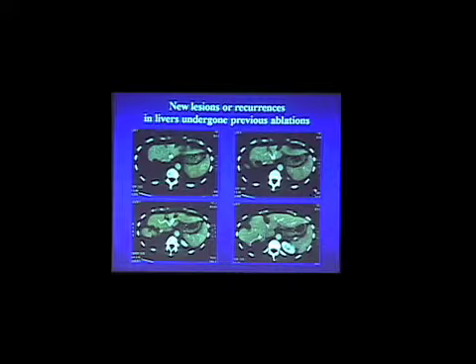A patient with colorectal NET, a young patient, who had received surgery again, and then he started to be ablated. Now we have ablated this young woman 9 times for new metastasis coming out. Chemotherapy does not work. Surgery cannot be repeated anytime. She comes back with this new lesion here in the middle of many other lesions treated. Very difficult to recognize this new lesion in the middle of so many treatments.